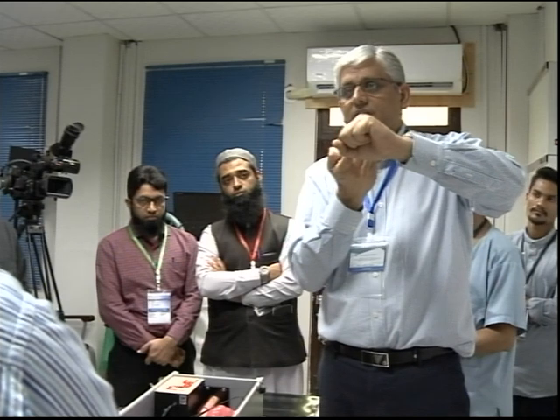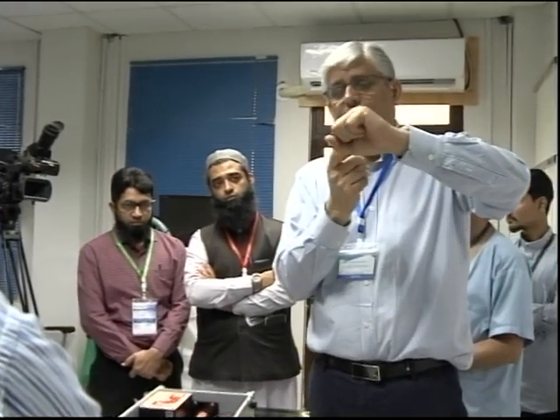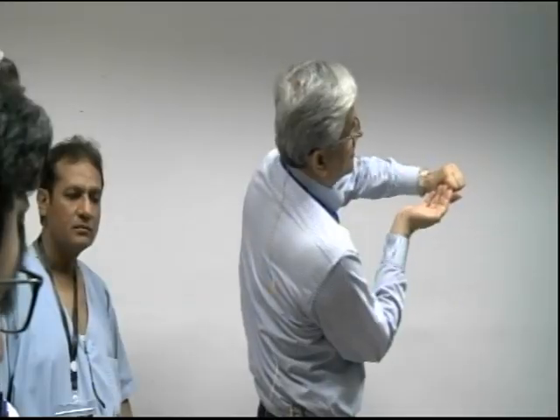But it should not be so far that your cannula, when it comes out, has a little bend. Your cannula, when it comes out, should be straight. Your tip shouldn't be bent like this, because at a distance it actually turns, and you can aim towards the roof. I think that's very important.